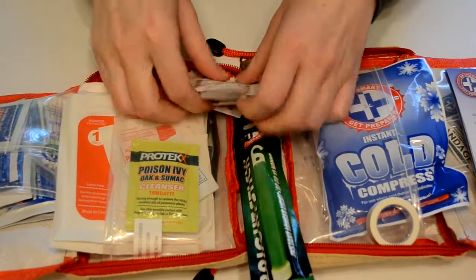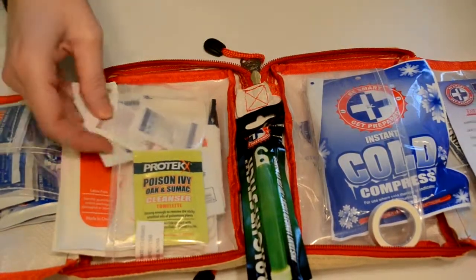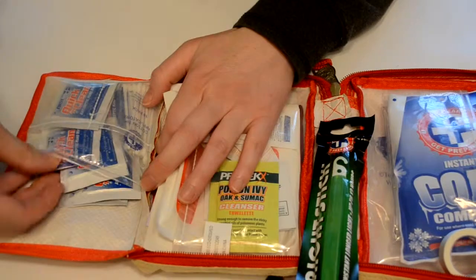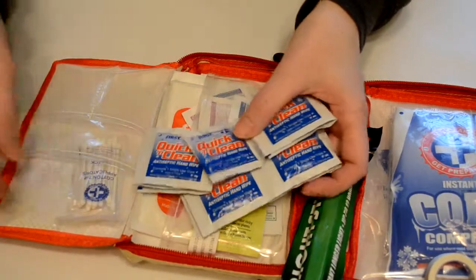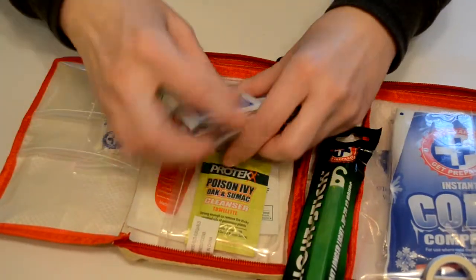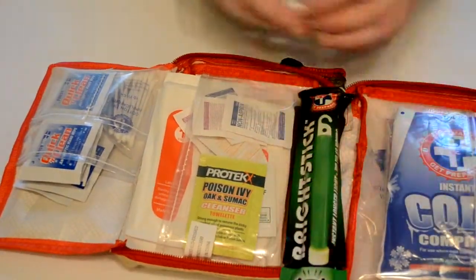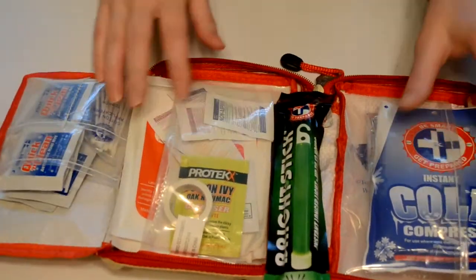It's a good idea to have some kind of a first aid kit with you so that you can treat somebody if they become ill or injured. And over here we have some quick cleansers, so antiseptic hand wipes, and we've got some cotton tip applicators.